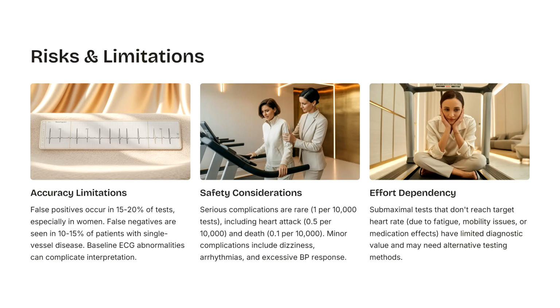Now, what are the risks and limitations of the TMT? Number one, accuracy limitations. False positives occur in 15 to 20% of cases, especially in women, because of the menstruation problem. False negatives are seen in 10 to 15% of patients with single vessel disease, which is not identified previously. Baseline ECG abnormalities can complicate the interpretation.